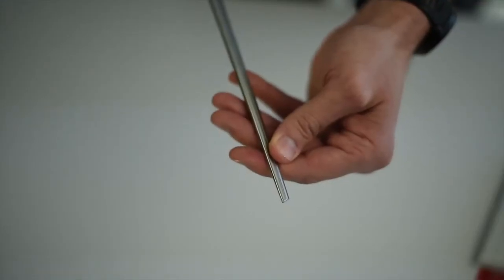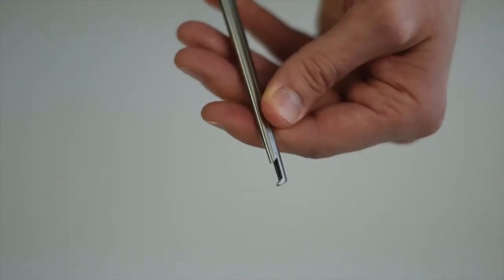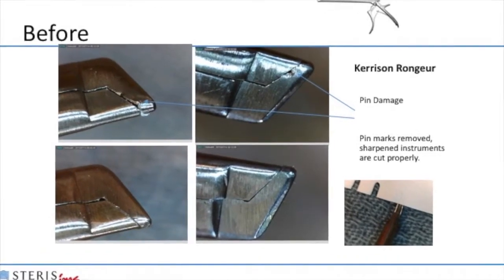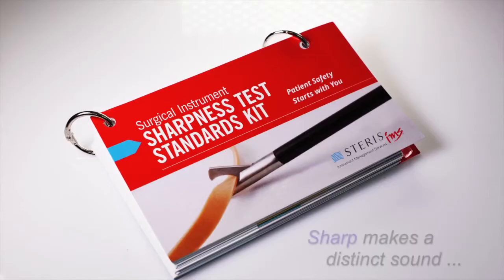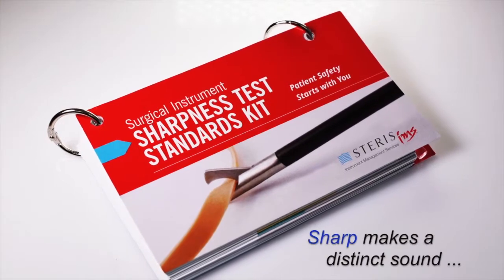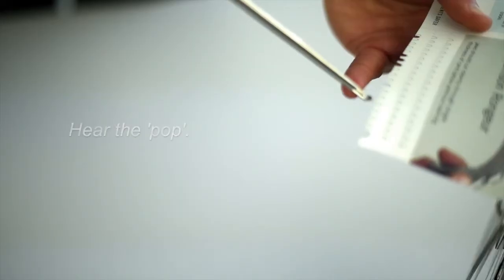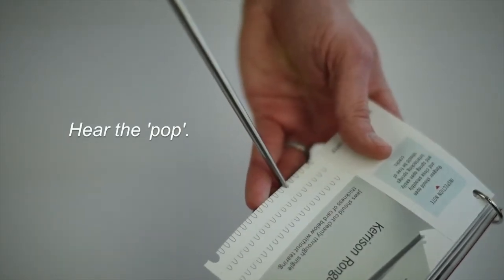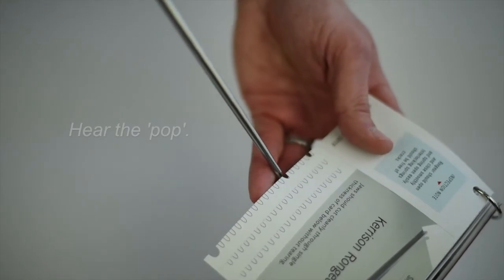Kerisons, just like scissors, have two sharp edges that have to work together to cut tissue. If one edge is sharp and the other isn't, it's not going to work. You should hear a pop and it should cleanly and crisply cut through the testing material.